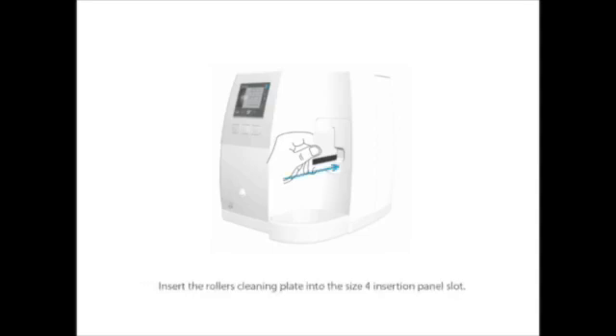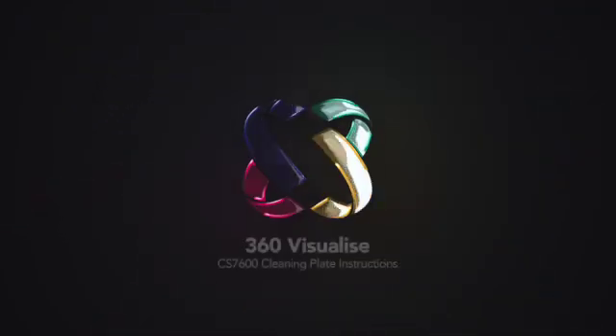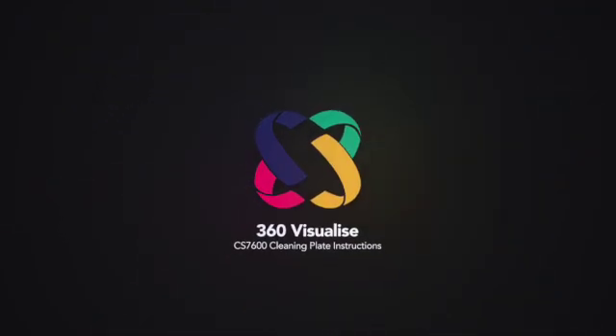Gently insert the roller cleaning plate into the size 4 insertion panel slot until the scanner rollers draw it in. When the cleaning procedure is complete, the scanner displays a message instructing you to remove the cleaning plate. Remove the roller cleaning plate from the insertion slot by gently pulling it out. The cleaning procedure should be repeated 3 times to ensure that the rollers are thoroughly cleaned.